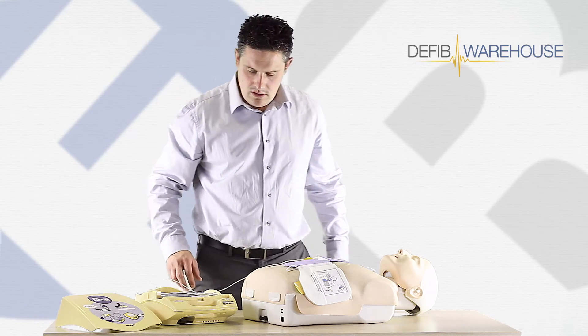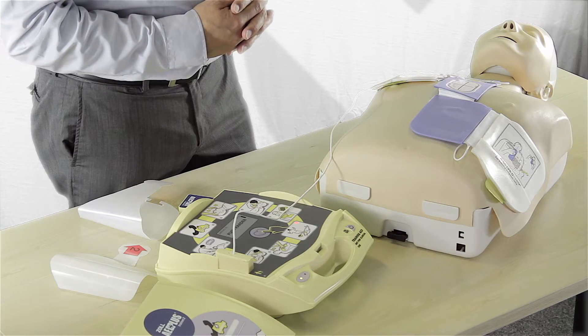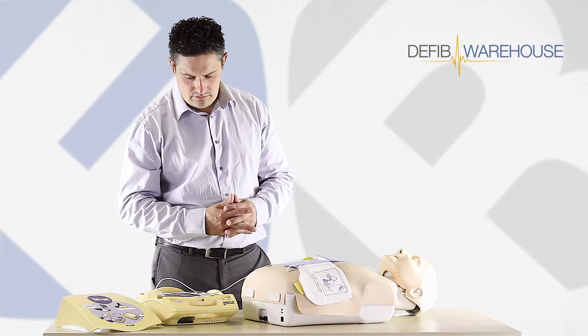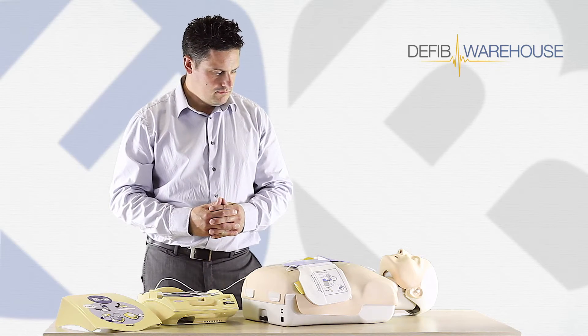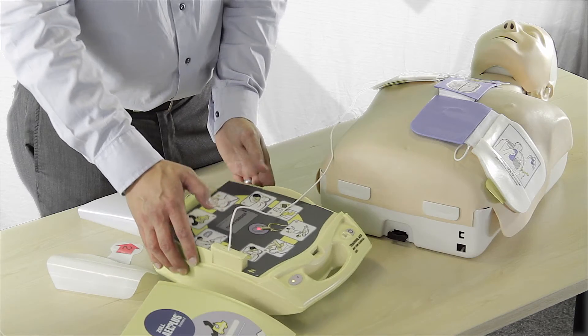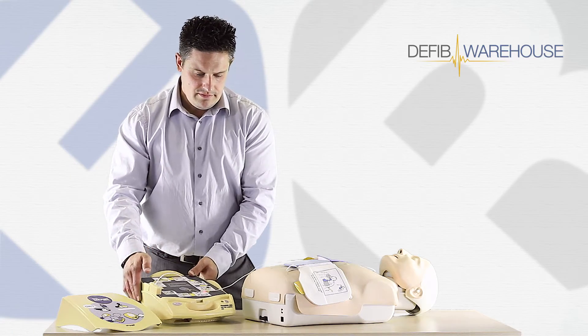Don't touch patient. Analyzing. Shock advised. Don't touch patient. Press flashing shock button — make sure everyone's clear. And we'll press the shock button. Shock delivered.